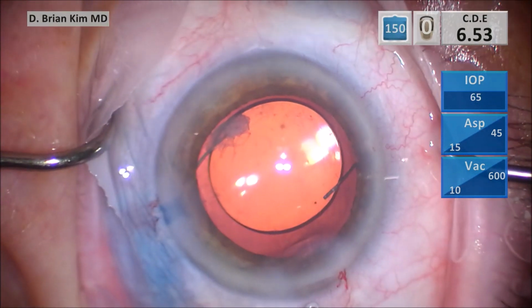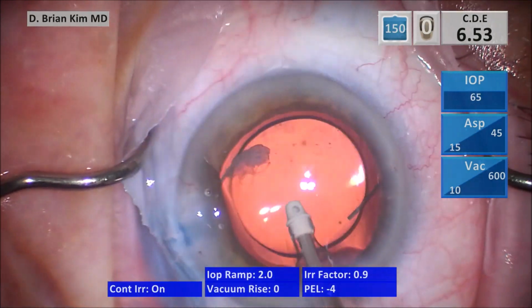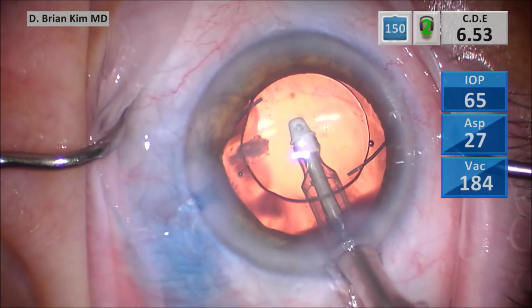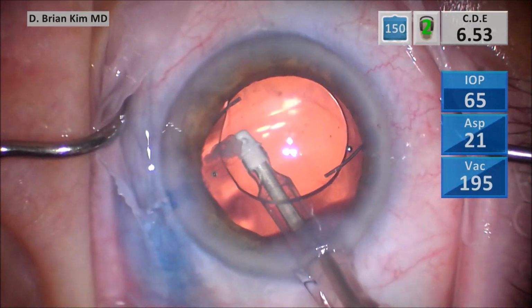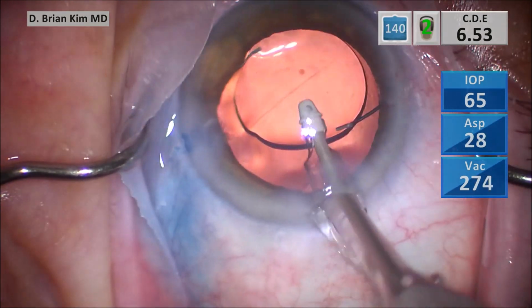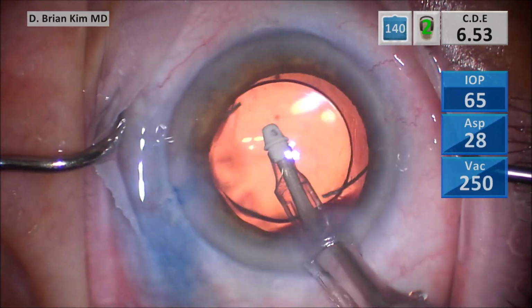I go in with the I/A with irrigation off, activate irrigation, go under the optic, remove the viscoelastic from within the bag. Remove all the viscoelastic from the anterior chamber, and then I'll hydrate my incision.